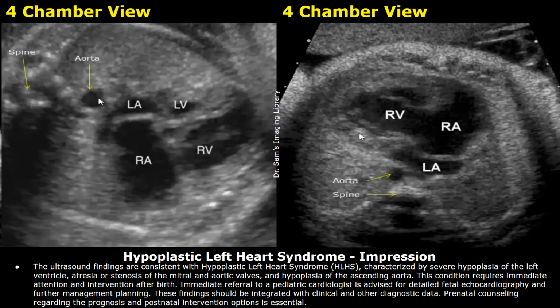Immediate referral to a pediatric cardiologist is advised for detailed fetal echocardiography and further management planning. These findings should be integrated with clinical and other diagnostic data. Prenatal counseling regarding the prognosis and postnatal intervention options is essential.